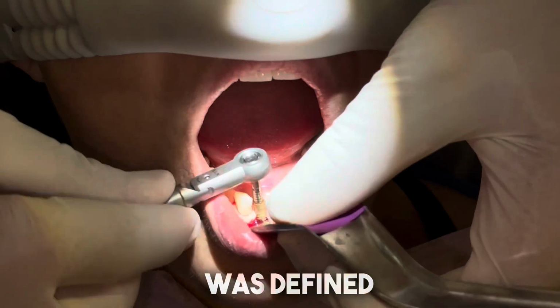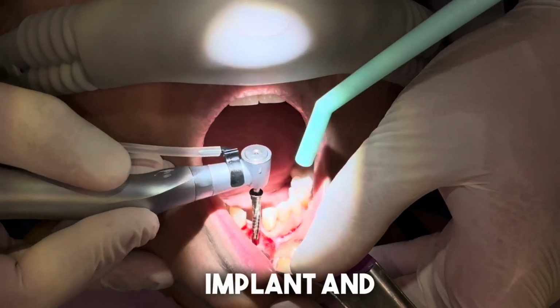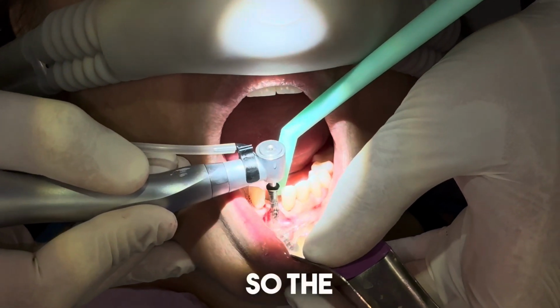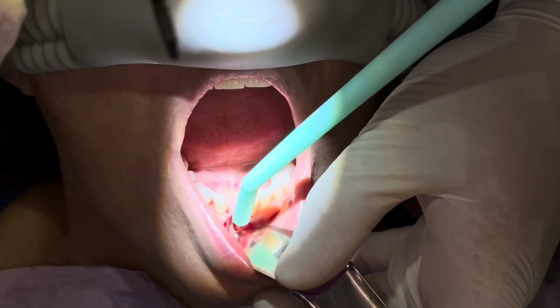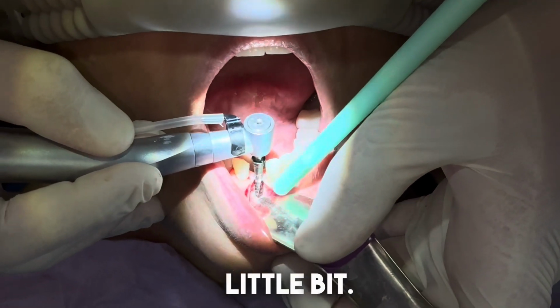The trajectory was defined by the CAD/CAM, and now we're trying to put the implant, and we want to widen it up a little bit so the implant goes in there without any stress on the jawbone. Again, the width is increased a little bit.